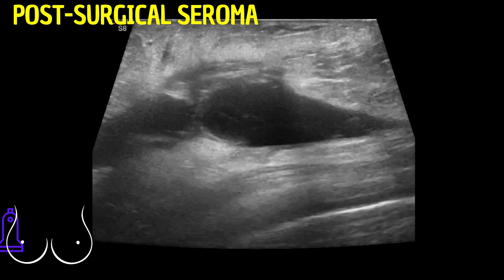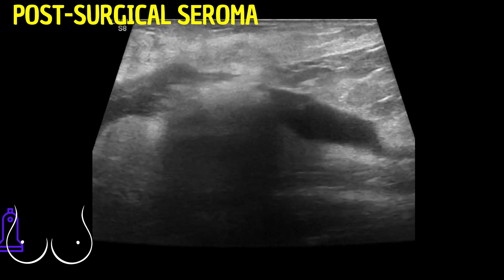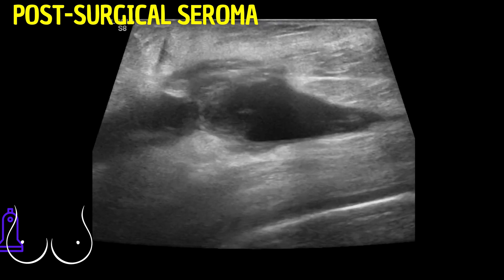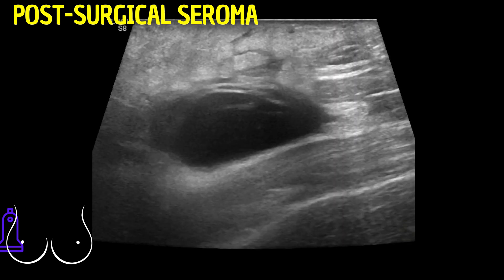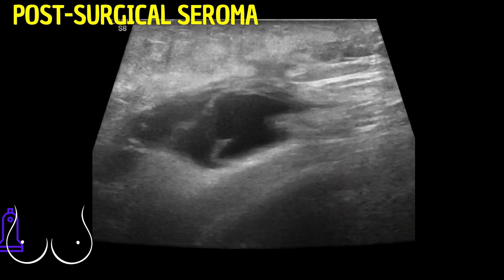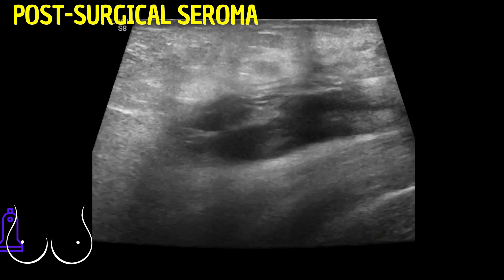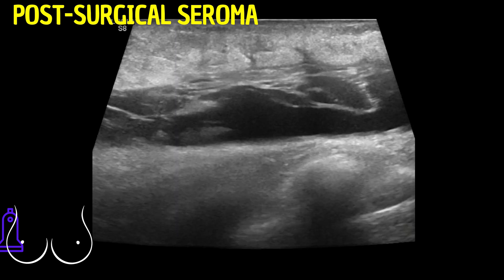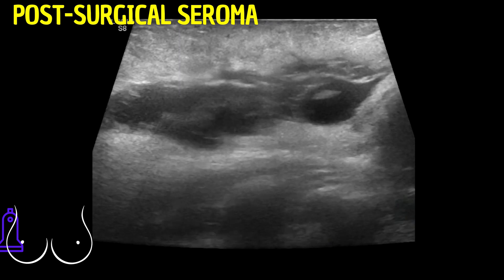The appearance of septations and slightly thickened walls in a seroma, while not altering its basic definition, indicates increased complexity, potentially leading to its classification as a complex or organized seroma in clinical practice.